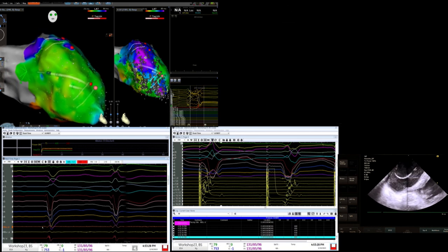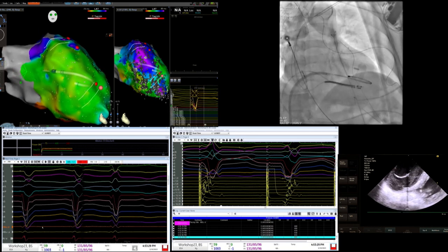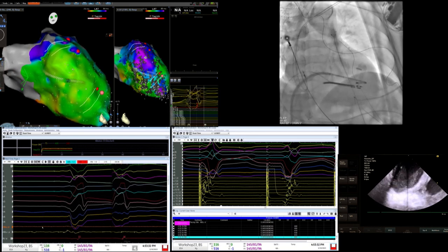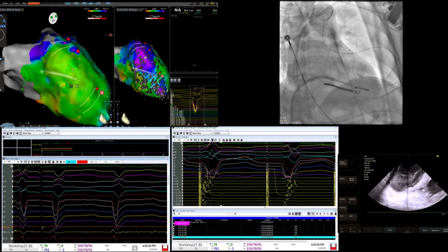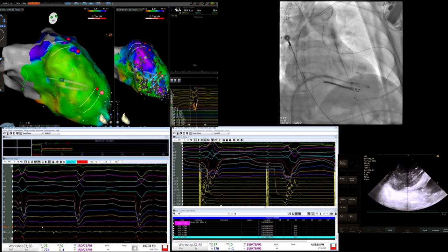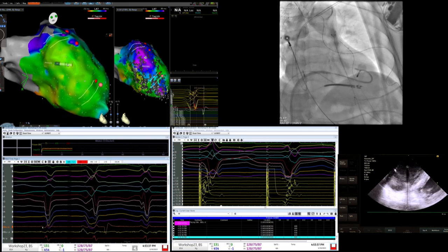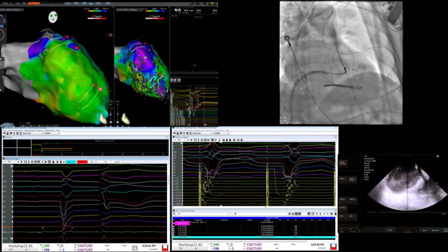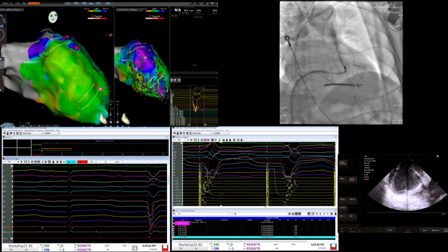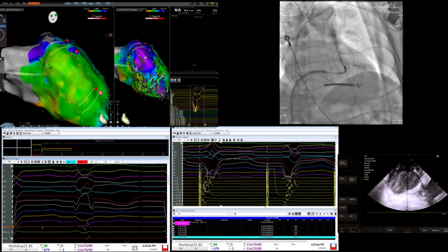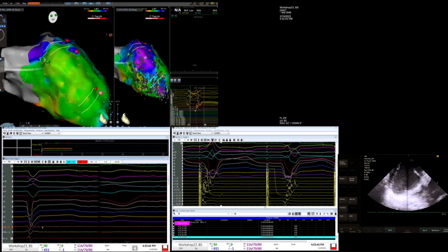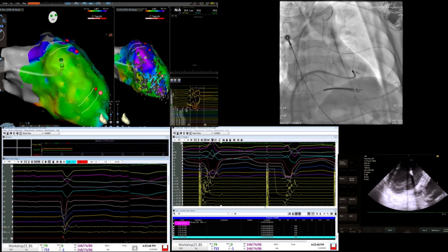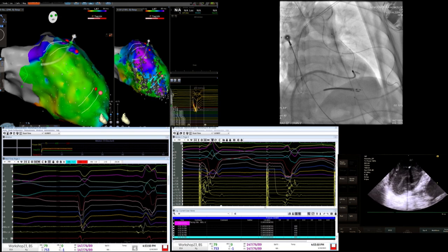Going to these areas that were late: after remapping, we found those areas in purple, went back and ablated them. You can still see there are LAVAs there but at the beginning those were much more prominent - demonstrating progressive elimination of slowly conducting tissue.